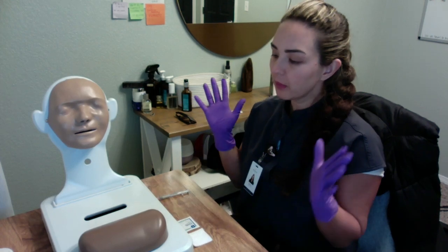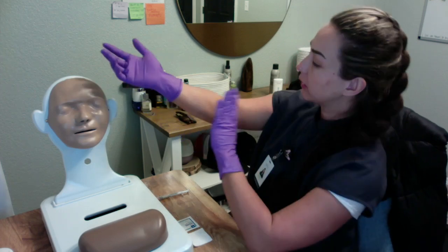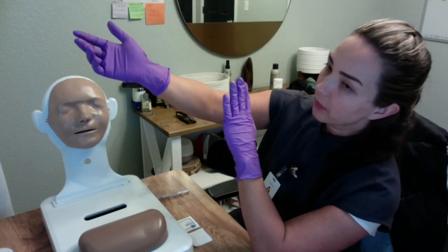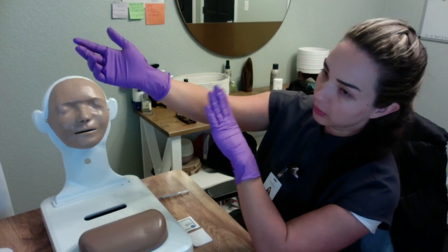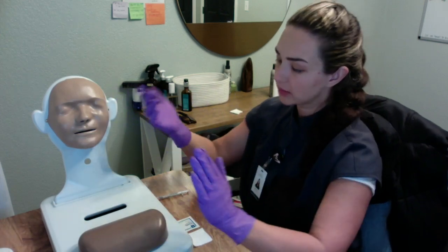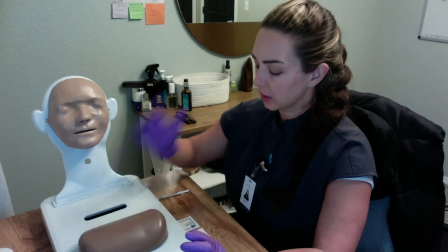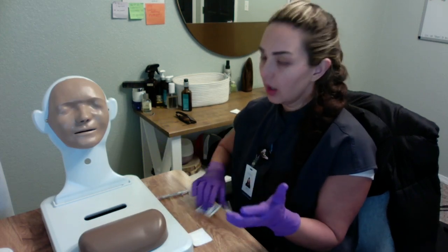So next we want to identify the location. So it's going to be 3 to 4 fingers below the antecubital space, and one hand width above the wrist. So we're going to do it about here on the patient. Now I haven't sanitized that, so it's okay for me to touch.